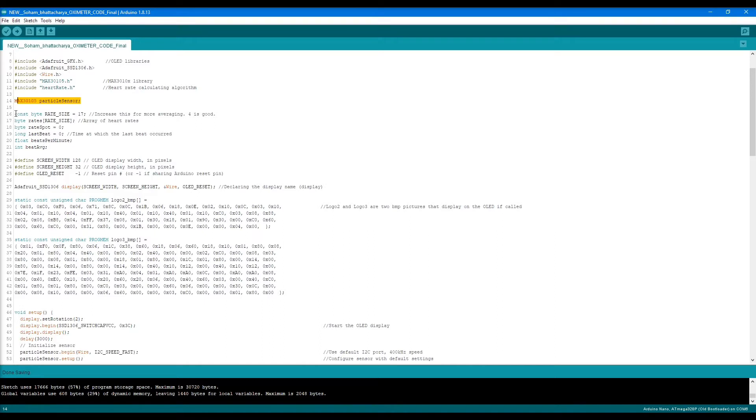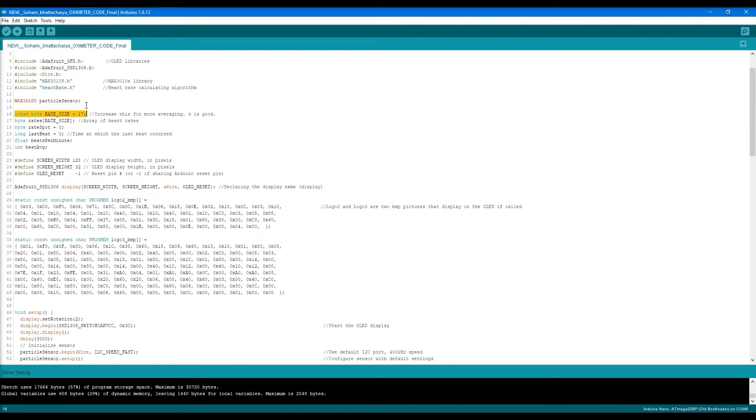Then we create some variables which store data. In line 16, this actually stores the number of averaging that the sensor or Arduino will do by capturing data through the sensor. It is written as 17 here, but it can be anything. The larger the number, the higher the processing time, so take care of that.